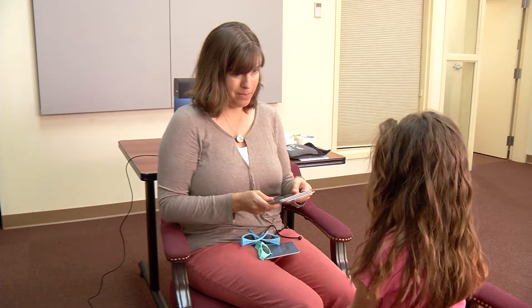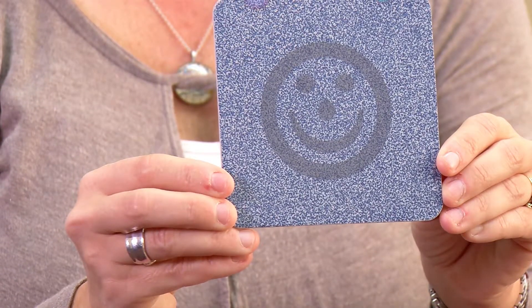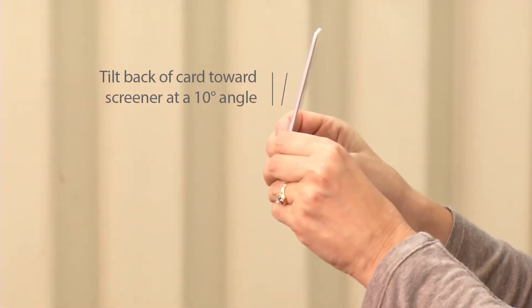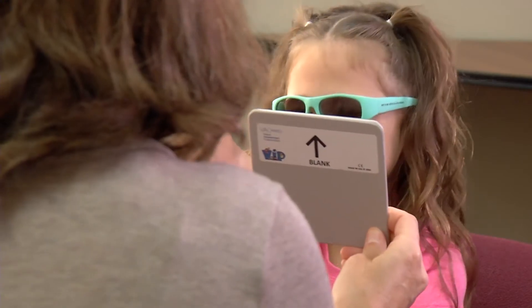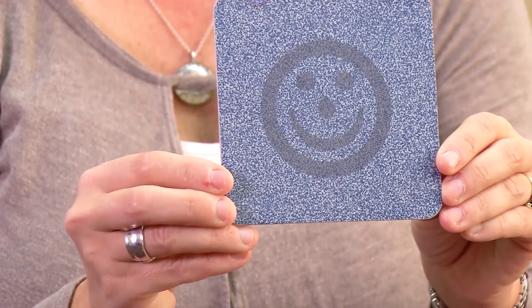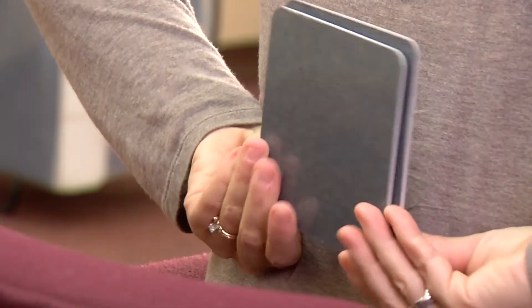Present the demo card, card A, to the child and ask the child to point to or identify the smiley face. Card A has a two-dimensional smiley face and is used for training purposes. Next, present card B and the blank card side by side in front of the child at eye height and at a 10-degree angle, tilting the back towards the examiner. Ask the child to point to the card with the smiley face. Shuffle card B and the blank card behind your back to randomly change the position of card B, then ask the child to identify the card with the smiley face. Shuffle the cards behind your back each time to avoid creating a pattern presentation.